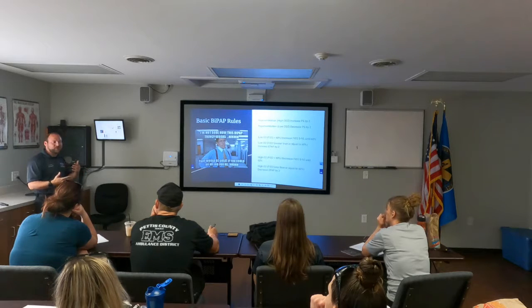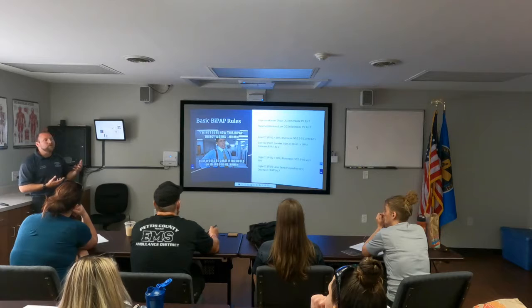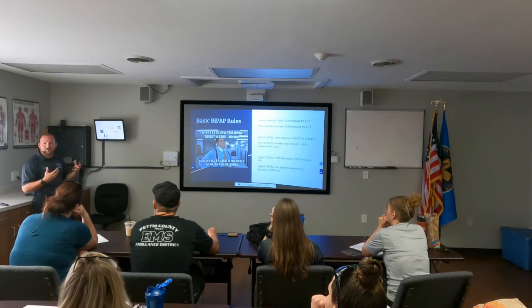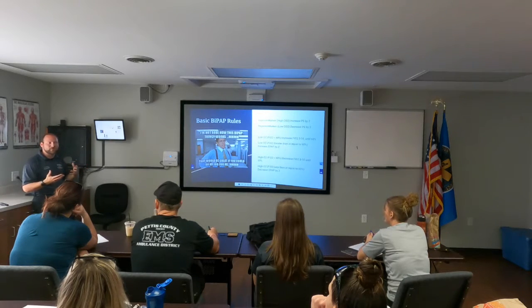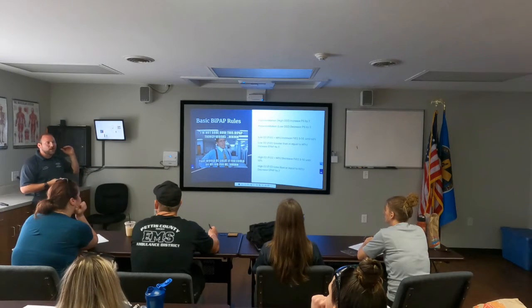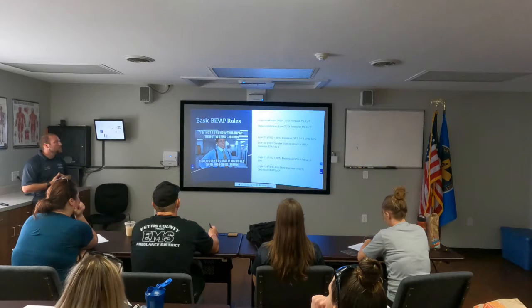And if you still want to make sure that you have that 5 or 10 gradient or variance between them, you're going to have to increase your IPAP as well, just to make up for that. We'll go over some scenarios as far as setting that up, going over those initial settings and seeing where you guys are at comfort-wise. Again, pressure support is just simply your IPAP minus your EPAP, and that's how we originally started.